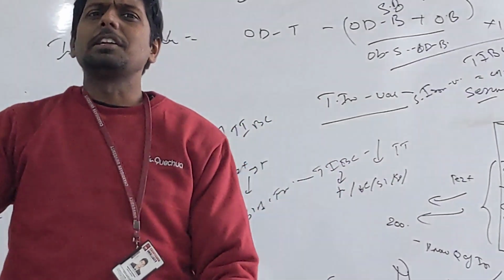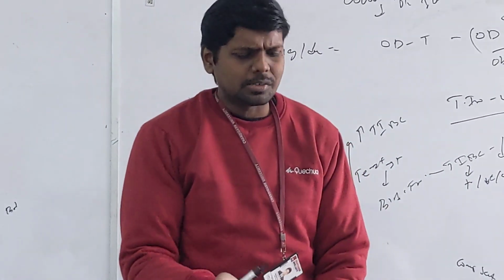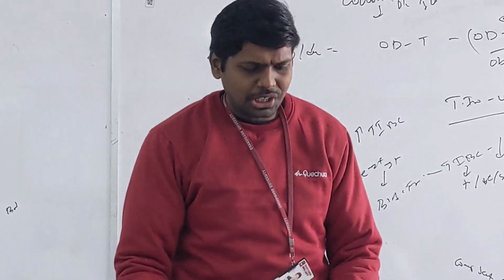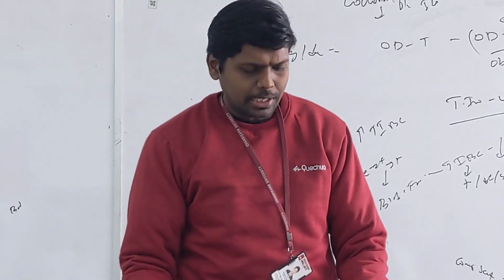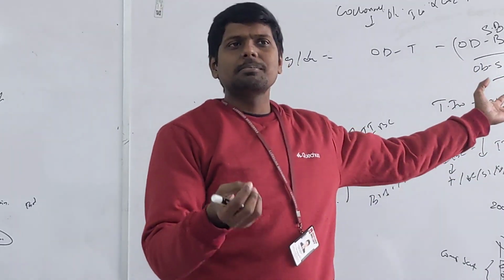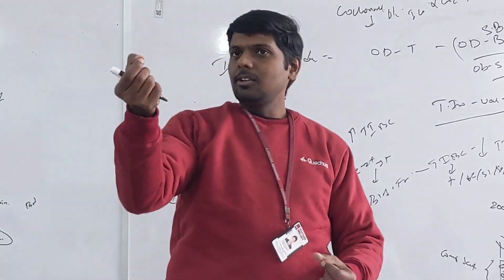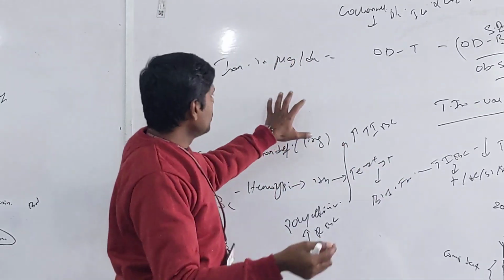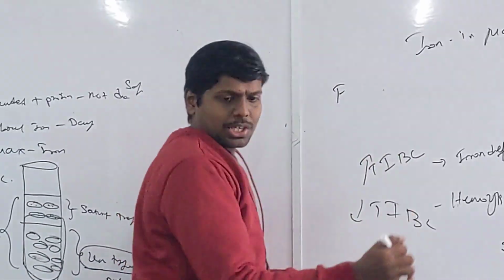Now there will be many technical terms from test to test. What are the names of buffers? There are various buffers: saturating reagent, precipitating reagent, iron reagent, distilled water, buffers. All these things will have the same components from kit to kit. They will have some acids. Okay, I will give you the reaction. The reaction will be like this.